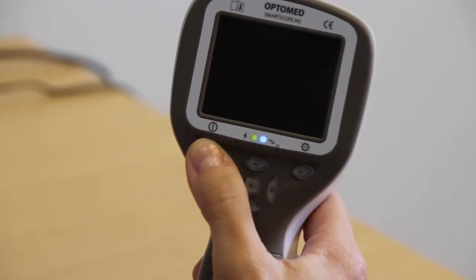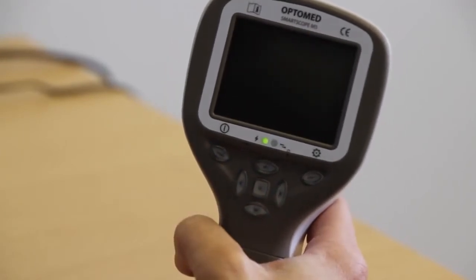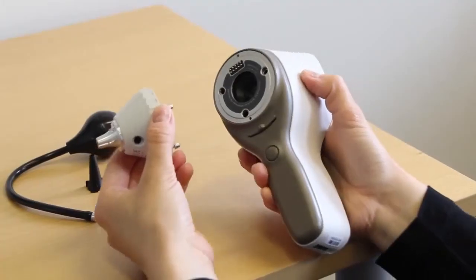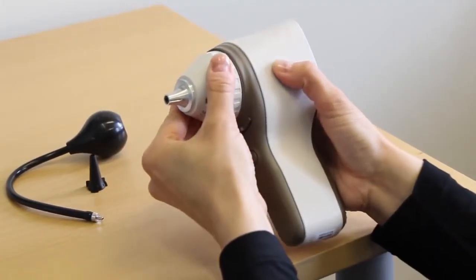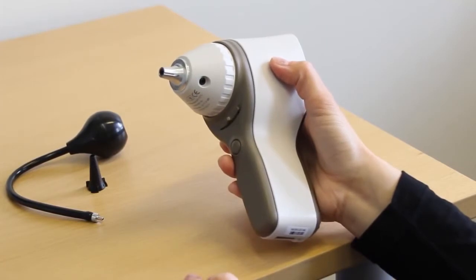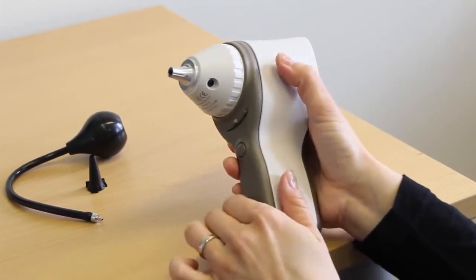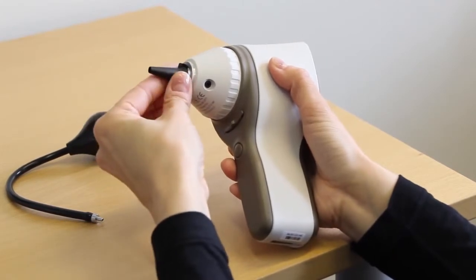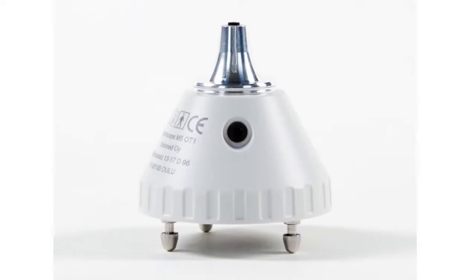Power on and off the device using the left soft key. Attach the OT1 Otoscopic optics module by pressing it firmly into place until you hear a click. Attach the speculum by twisting it into place. The OT1 optics module can be used with any widely available Welch Allyn or Heine speculum.